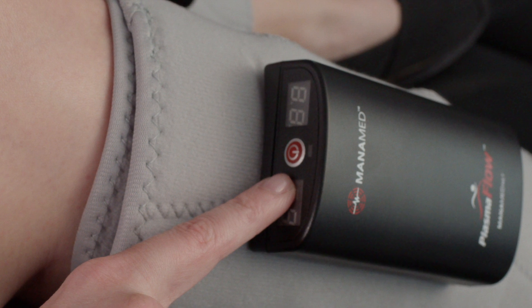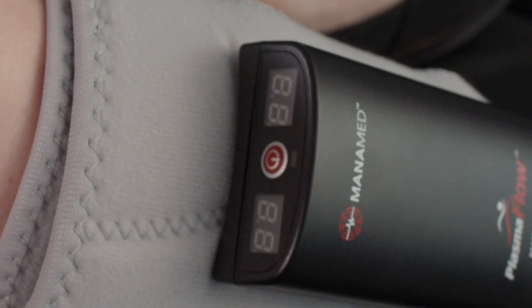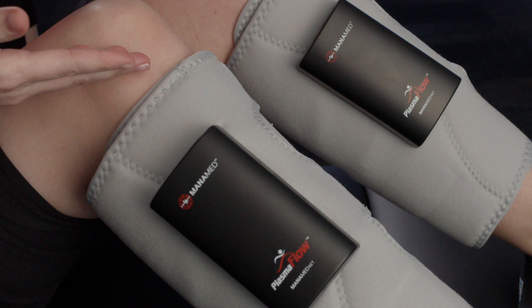If you do not see the red power button while the cuff is on your leg, the unit is upside down and should be reapplied correctly. The top part of the wrap should be just below the bottom of the patella, or kneecap.